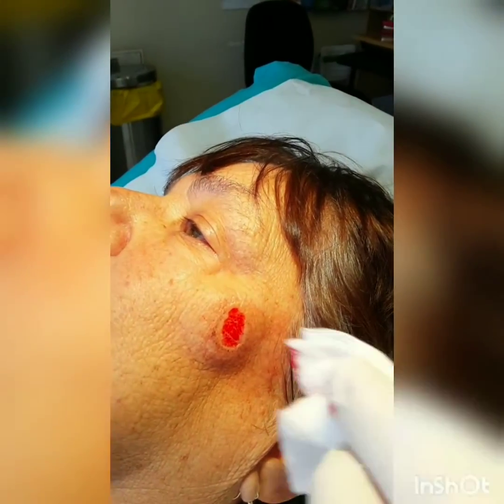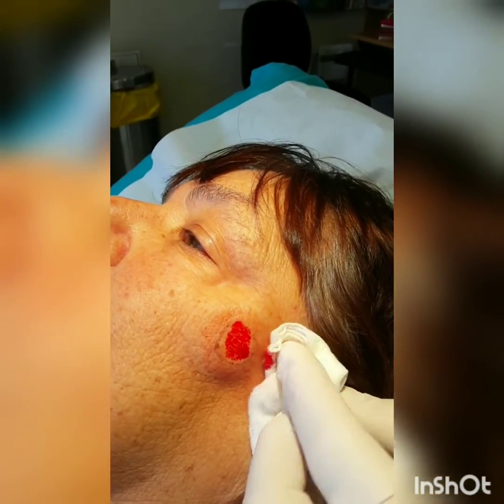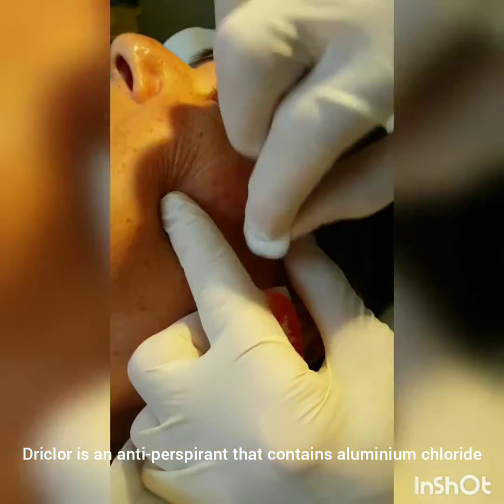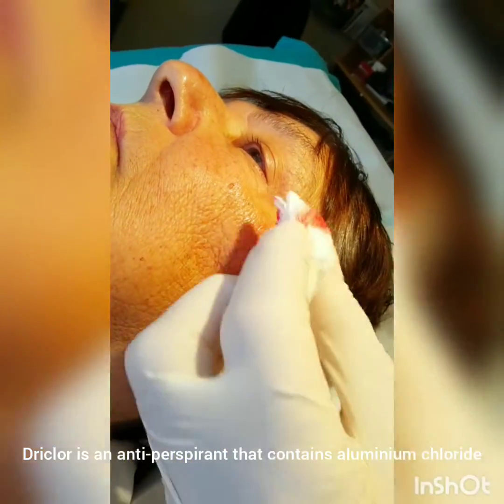To stop the bleeding, we can either hyfrecate the area, or in this case we're using a solution called Drysol, which we then rub into the area to stop the bleeding.